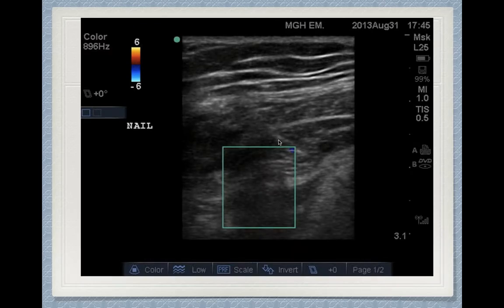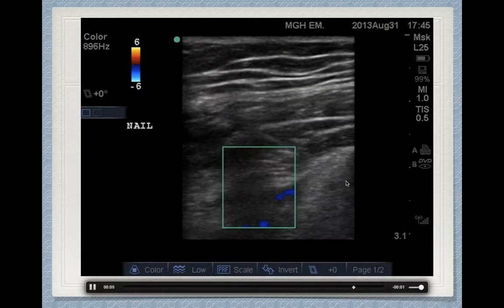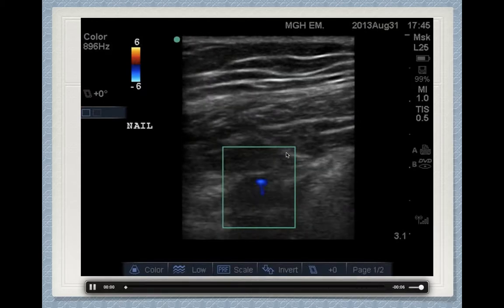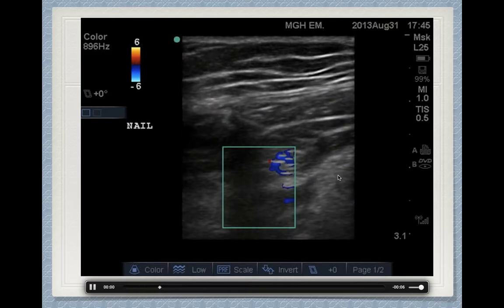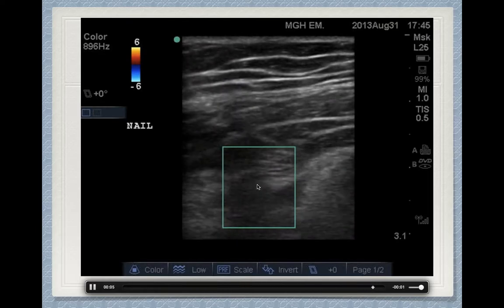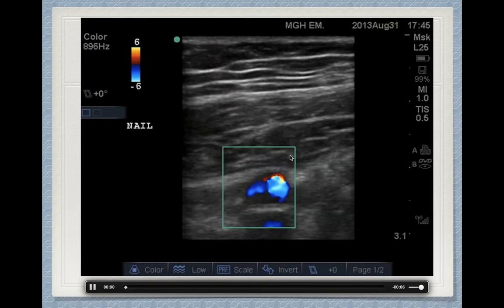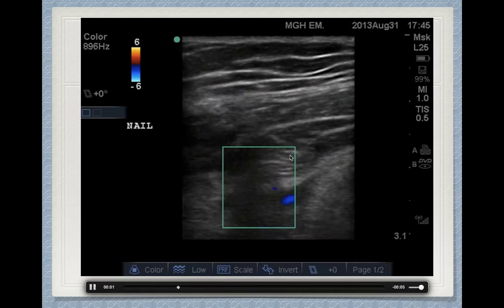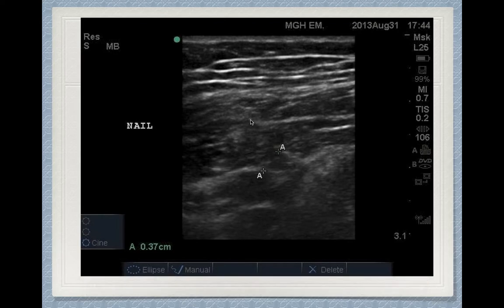And then lastly, this was a case I had last year of a nail in someone's thigh. Here's the nail here. It's just bright white. Long. It's a roofer, I think. So a roofing nail is pretty long, and it's bright white here. It assisted me with taking this nail out. I just used ultrasound. The reason I did is because the artery is right here. So as you can see, he missed a potentially leg-threatening injury by 0.3 centimeters. So this is a nail here. It's passing through this way, and this is the superficial aspect of the artery.